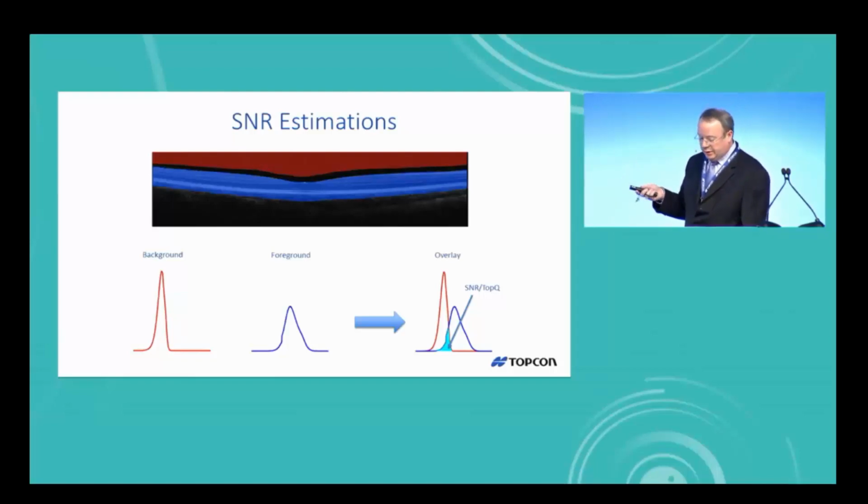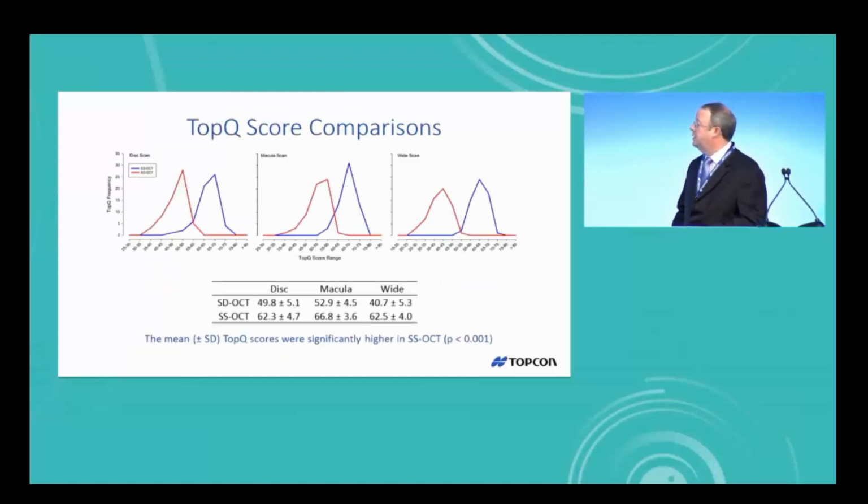Now, one thing to note here is that we're actually calculating the extent of the similarity and overlap, not simply looking at the degree of overlap on the x-axis. So these calculations have a very high repeatability, or a very low coefficient of variation associated with them.